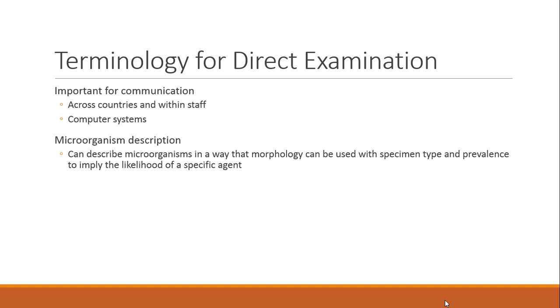Okay, terminology for direct exam. It's important to standardize how we talk about microbiology and how we communicate results. That way we can be on the same page, not only with our coworkers but also physicians and nurses. We can communicate with people in different countries. We can use the same computer systems. They're all set up basically the same.